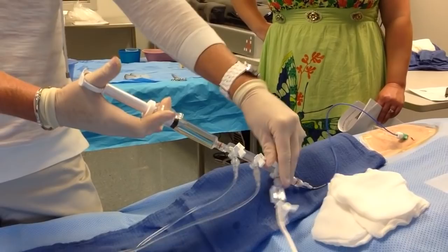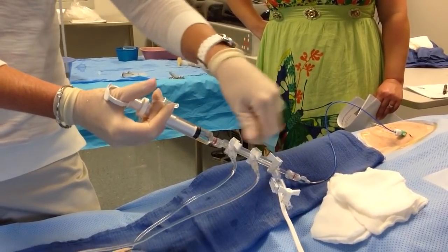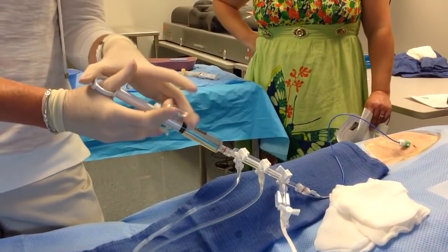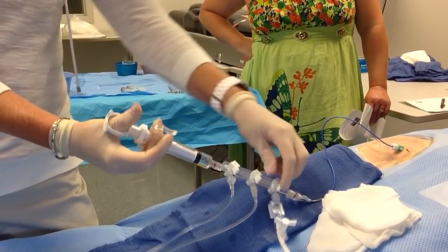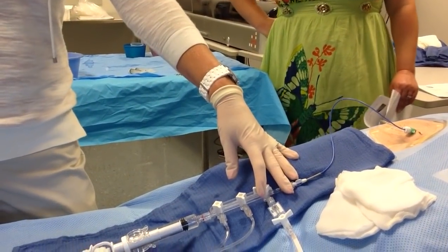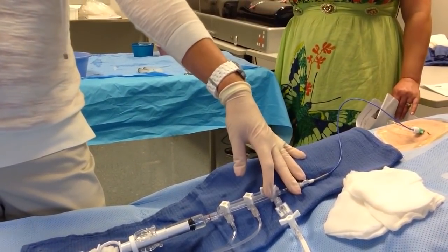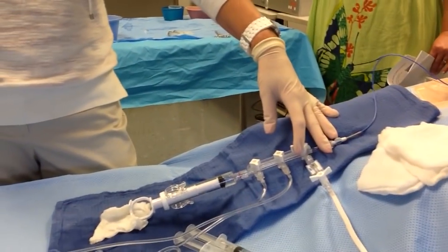I'm going to take a picture. Back on pressure. They usually do 2 to 3 at the right. Let me take another picture. Now, I'm going pretty quick here. And the case does go fairly quickly, but when you inject, it just takes a couple seconds, and they manipulate, move the camera around to get in another position, and then you take another picture.